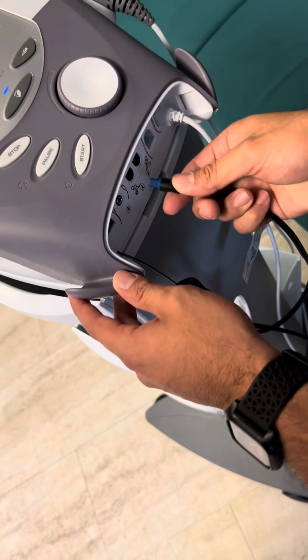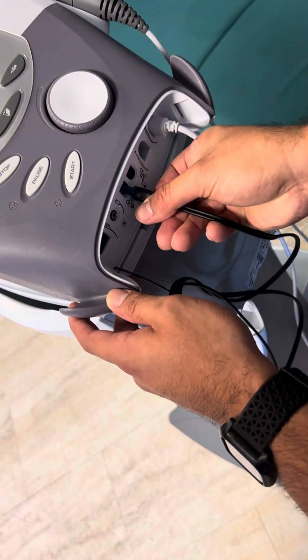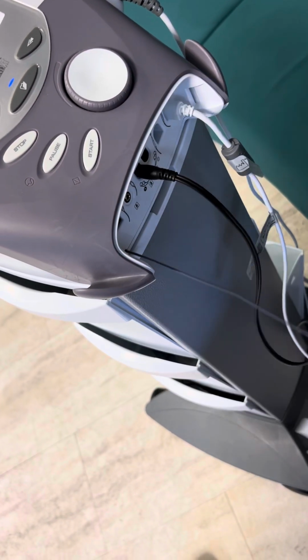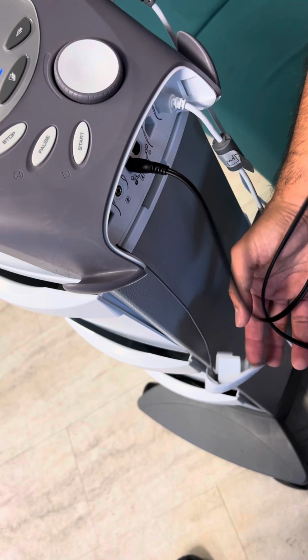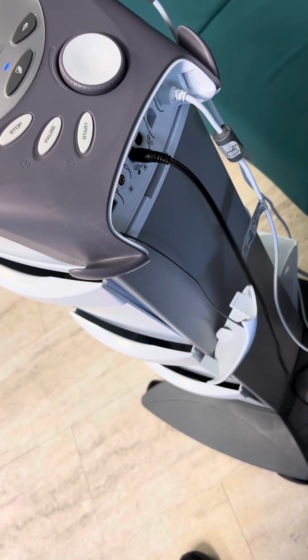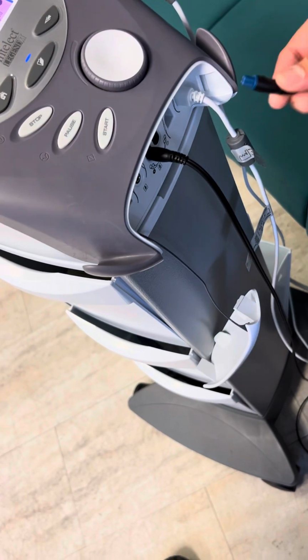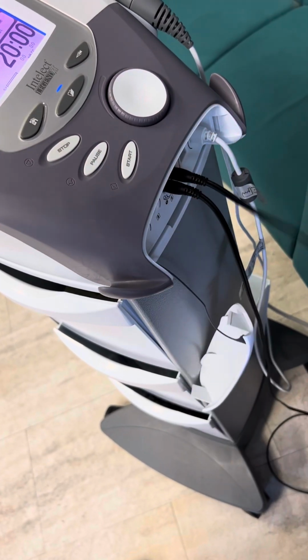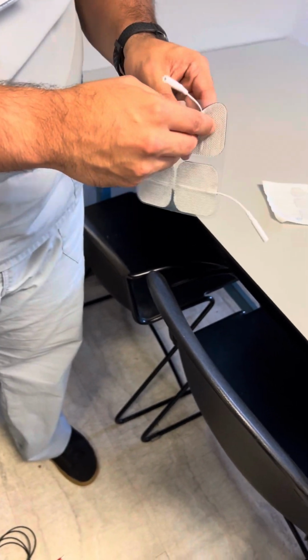First things first, actually. I'm going to go ahead and connect these wires. I'm going to connect these on the bottom here. There we go. That's one. Here. Cool. That's 2. All right. And then the electrodes. And then Andrea, would you mind helping me place these real quick?